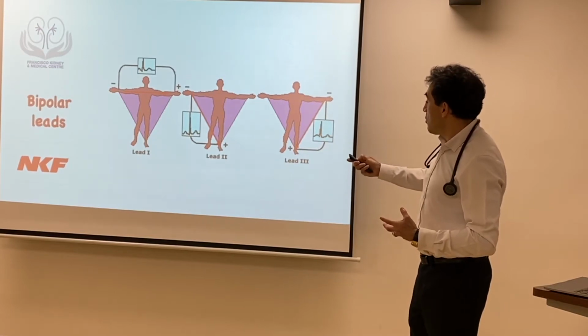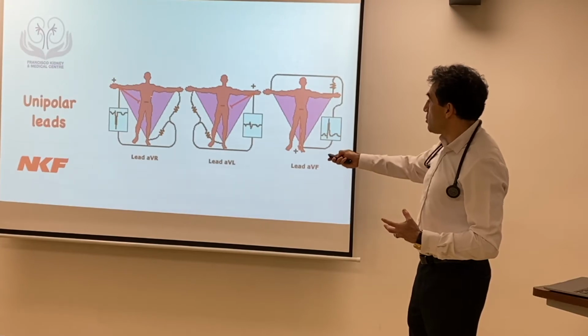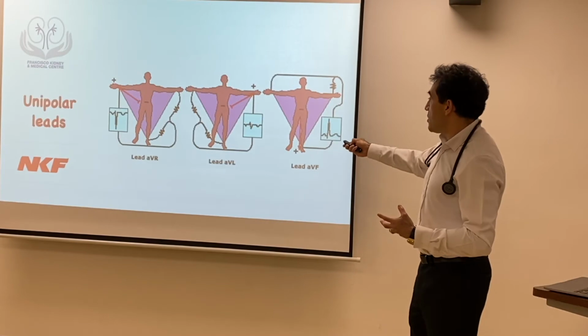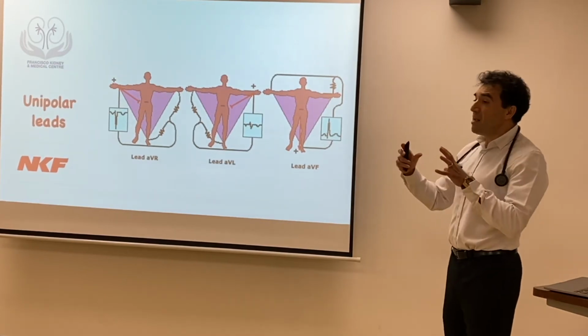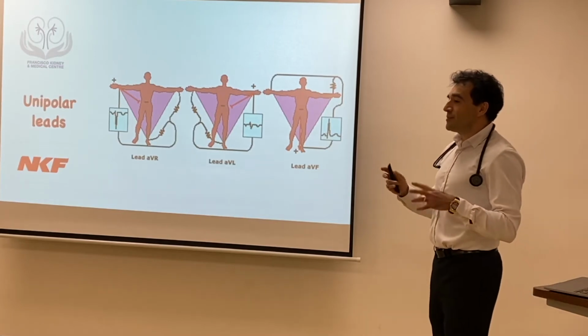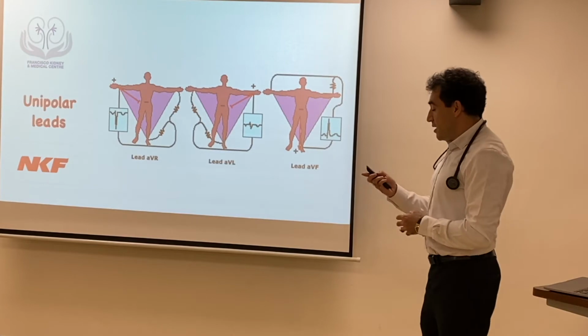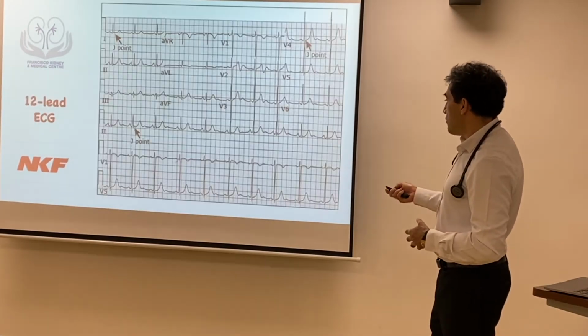Now, what you're watching is what happens more or less from the heart, or neutral position, towards that electrode, and this one towards this electrode. It's still two-dimensional, but you imagine you're watching the electrical activity from here, from there, from that, and you get a better picture of the electrical activity of the heart.